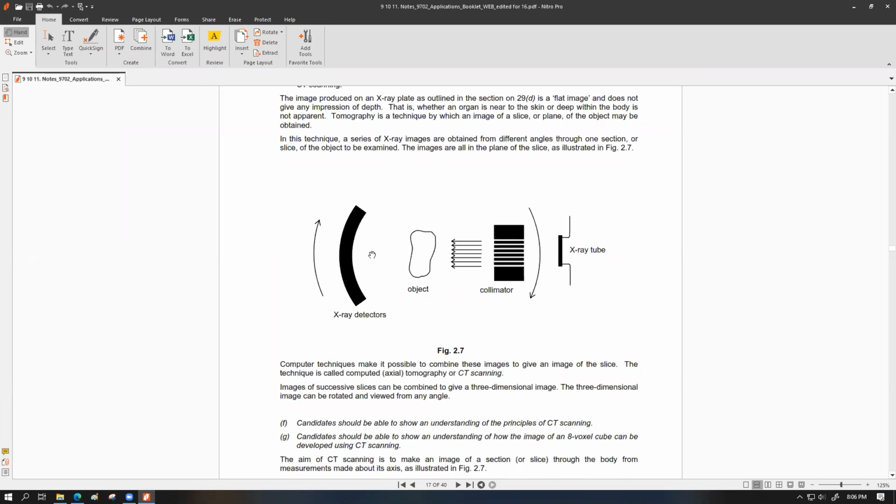Now, what do I mean by pixel equivalent for a 3-dimensional case? It means that for a 2-dimensional case, you only have a square to deal with that should have a specific color. For a 3-dimensional case, you have the x-axis, y-axis, and then think about the z-axis. So if you have a large cube that is broken down into smaller cube structures, each of those small cubes can work as a voxel.